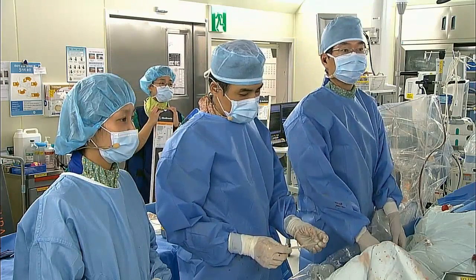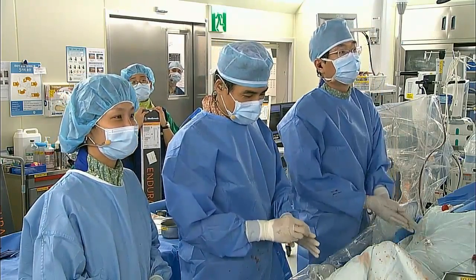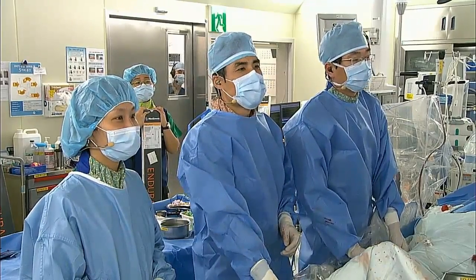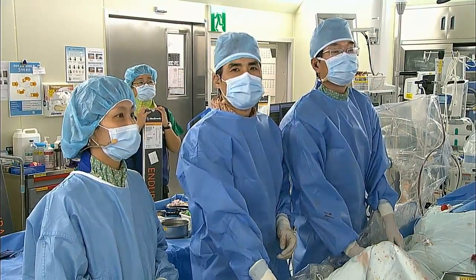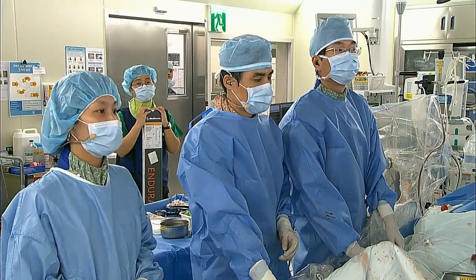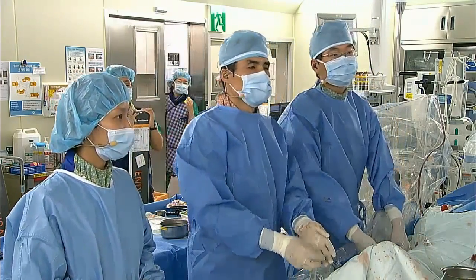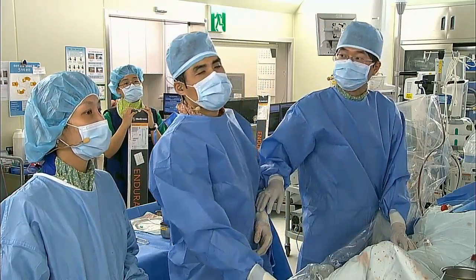Good morning. Can you hear us? Yeah. Good morning. I'm Dr. Lee from Asan Medical Center. Good. Bob Bersin here, your moderator, and also Kishore Sieunarine is with me, co-moderating. We have a distinguished panel of more than half a dozen physicians from around the world. So with that, why don't you go ahead and introduce us to your case? I understand it's an endovascular aneurysm repair.